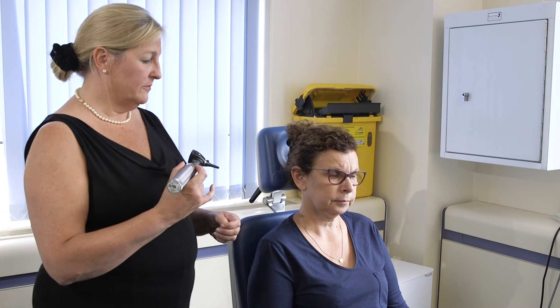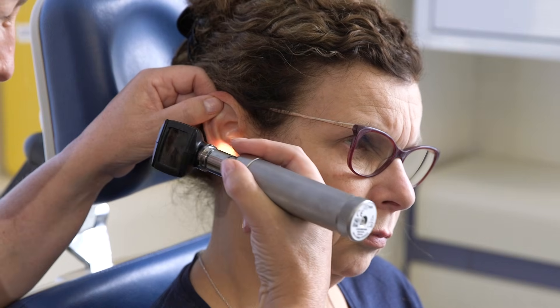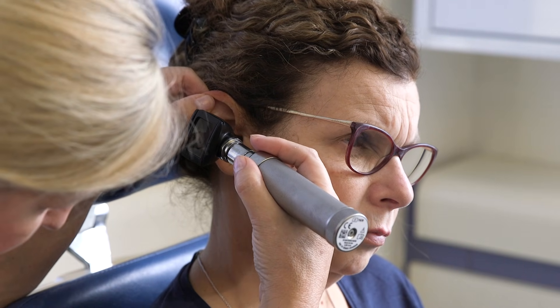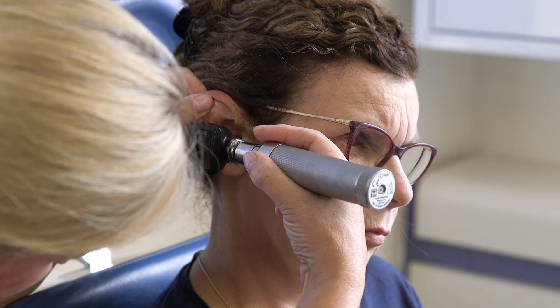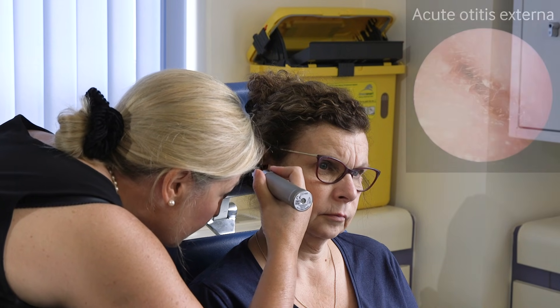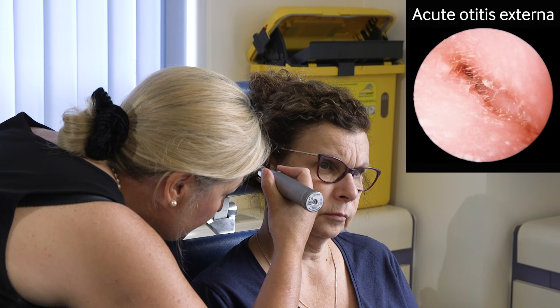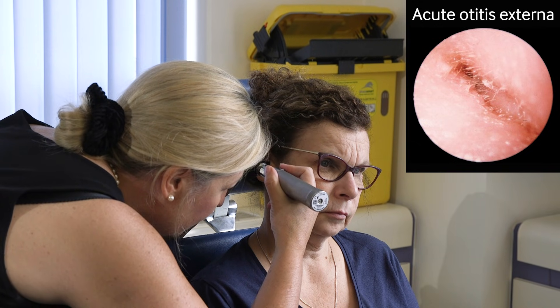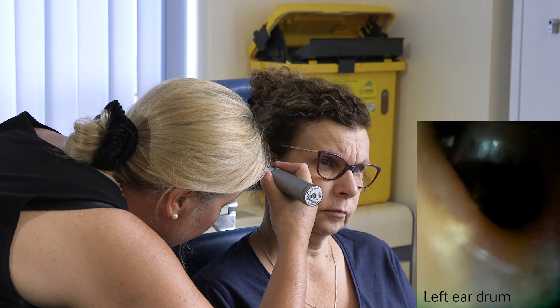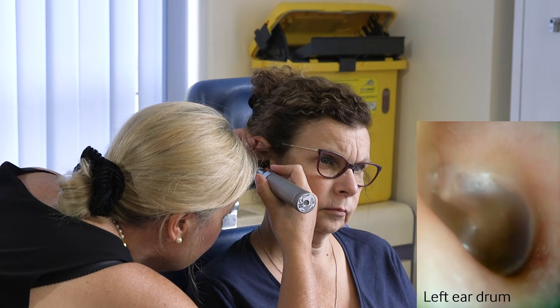When you insert the otoscope you pull the pinna backwards and slightly upwards, looking as you go to insert. You do not want to touch the ear canal skin because this is very tender. You then gradually insert, looking at the full circumference of the ear canal to determine if there's any infection or discharge present. Then if the ear canal is free of wax and other debris you should be able to see the eardrum.